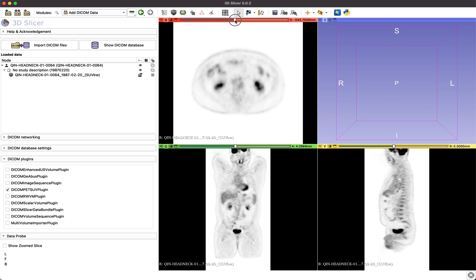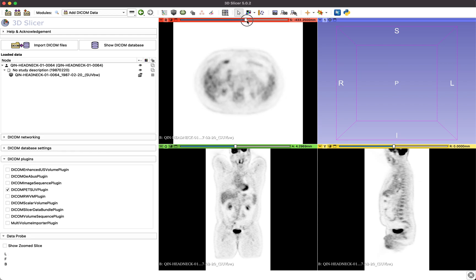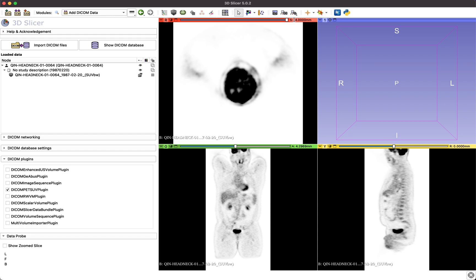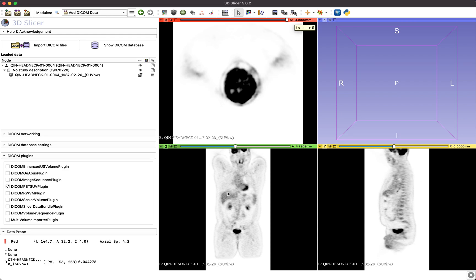In addition, the plugin will adjust the data set display settings to a default visualization for PET scans most physicians are accustomed to using. Regions with high uptake will be displayed darker than regions with lower uptake. To verify SUV normalization, we can navigate to the liver in this FDG-18 PET scan and check its uptake values. The liver in this data set has uptake values in the range of 2 to 2.5 SUV units.